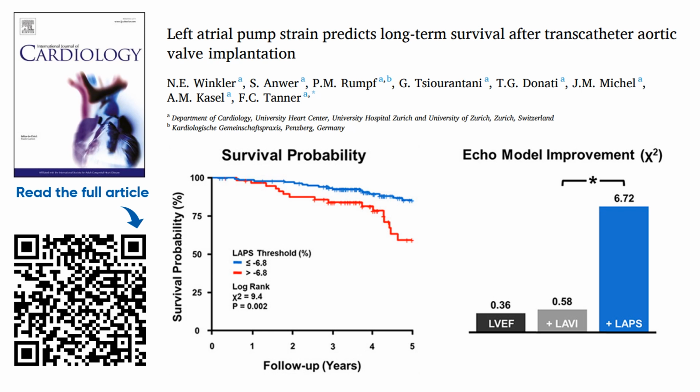Left atrial pump strain seems to be useful for risk stratification in those groups of patients who had severe aortic stenosis and underwent TAVI, and this can assist later in the timely decision of valve replacement.